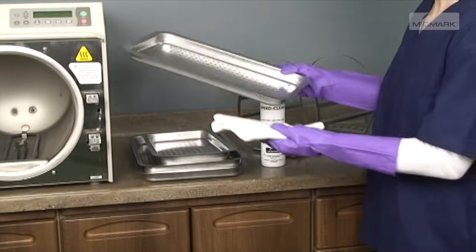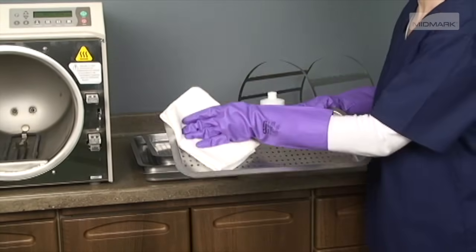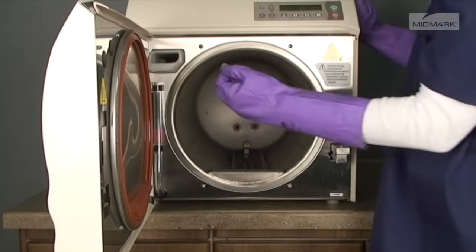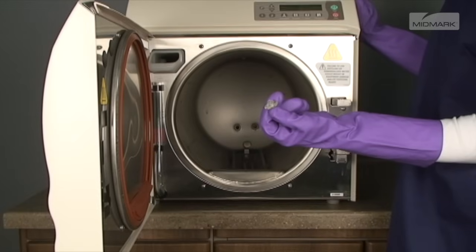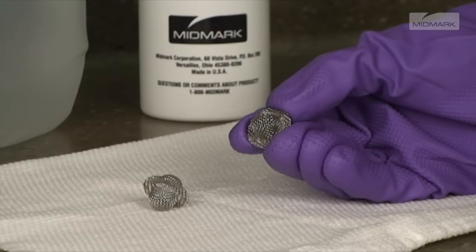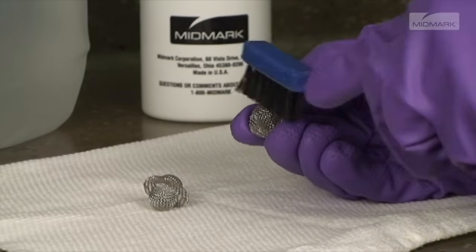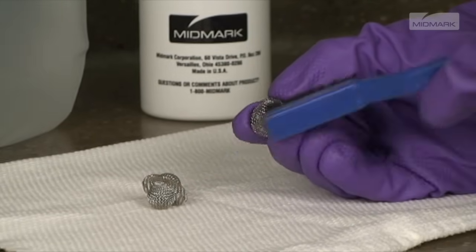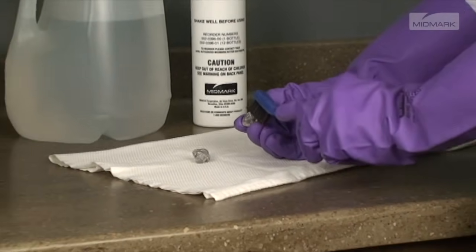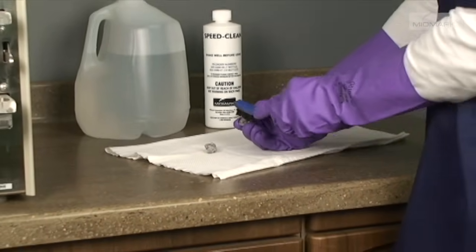Remove the trays and tray rack and wipe with a damp cloth. Next, remove and clean filters. Remove filters by pulling upward and twisting slightly. Filters should be cleaned by washing with a mild soap and distilled water solution. Use a small stiff brush or an ultrasonic cleaner to remove stubborn deposits. After cleaning, rinse the filters with distilled water and set them aside.